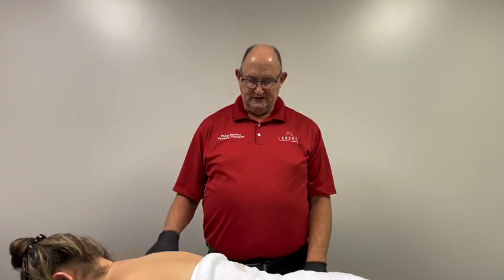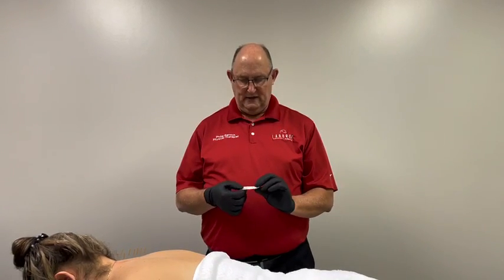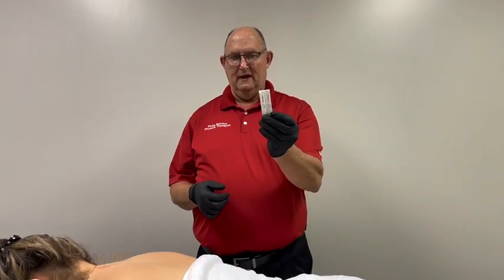So this is a short video on what trigger point dry needling is. Trigger point dry needling is a tool that a therapist would use to work on any musculoskeletal problem. It usually does really well on the spinal issues, from headaches to cervical pain to lumbar pain, even piriformis pain and SI joint dysfunction.